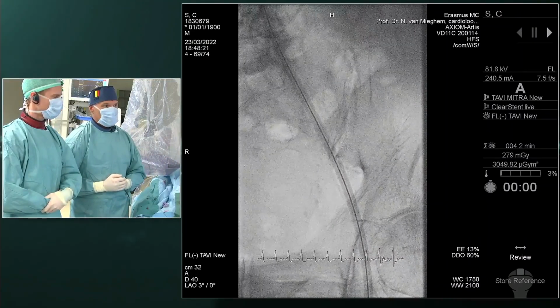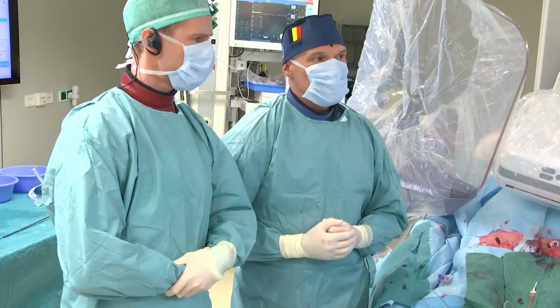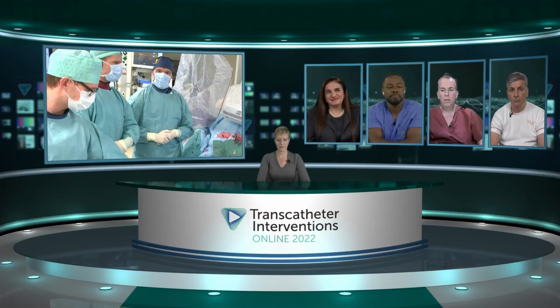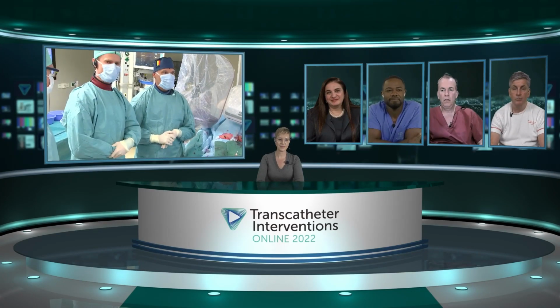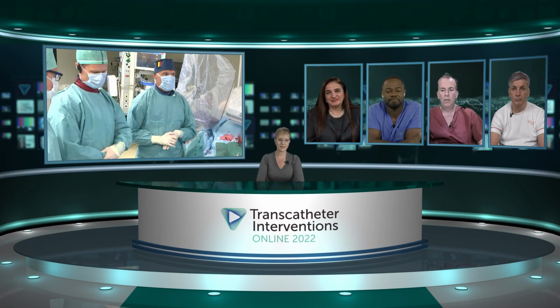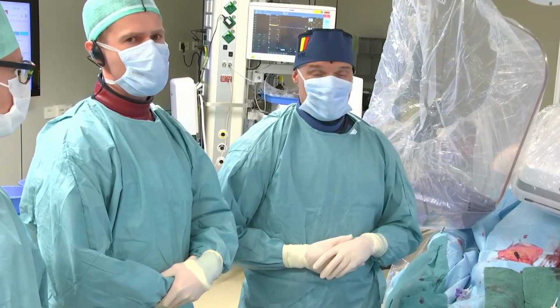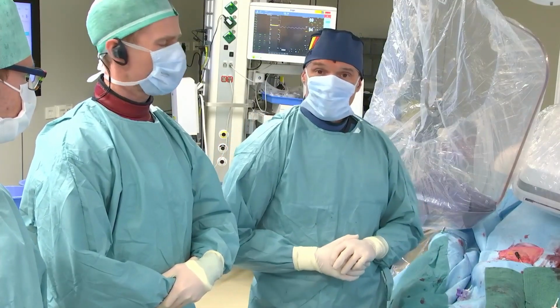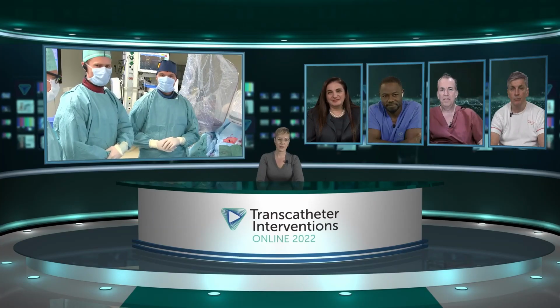So what we're going to do is continue with the valve implant as you move to New York. And then when you're done in New York, you will be coming back to Erasmus, and then hopefully we can show you the valve implant, and then we will take care of the closure, which might end up being challenging as well, because we already used 4 Perclose ProStyles as a pre-closure. So we'll take it from there.